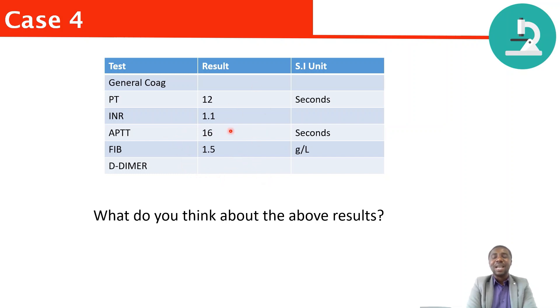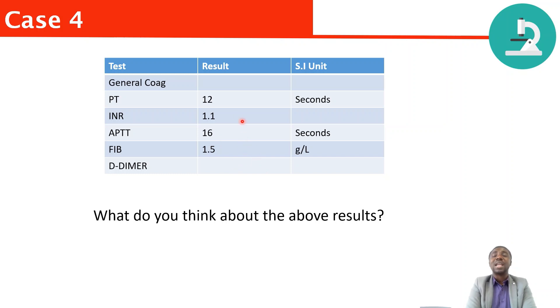What I want you to understand is that once you see this kind of result, you check it for a clot. I would expect this sample to be clotted. Once you've seen the clot, you reject the sample and ask for a repeat. So that's what happened on this occasion.